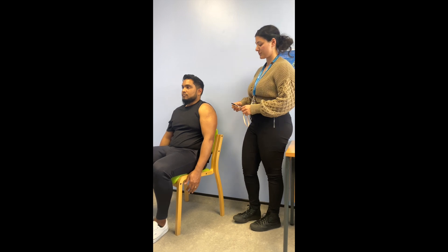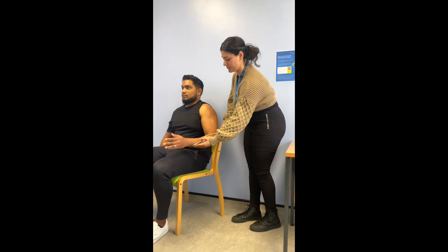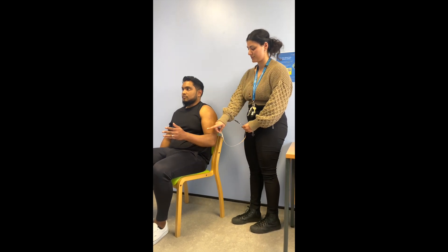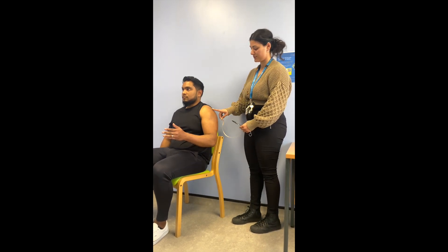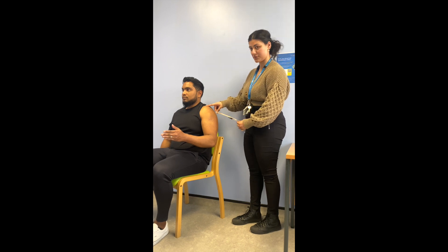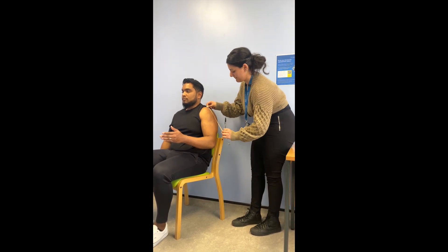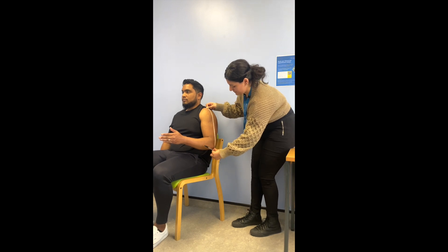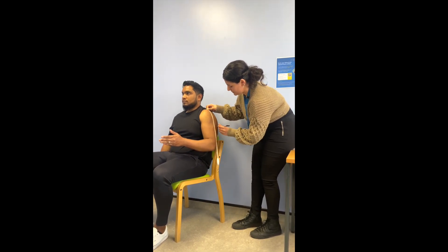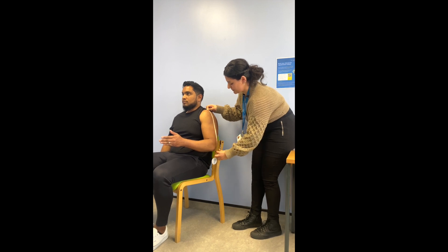To measure a resident's MUAC, place the resident's non-dominant arm at a right angle, with their upper arm parallel to the side of their body. Using a tape measure, measure from the bony protrusion of the shoulder to the point of the elbow and mark the midpoint. Make sure to measure this in centimetres.